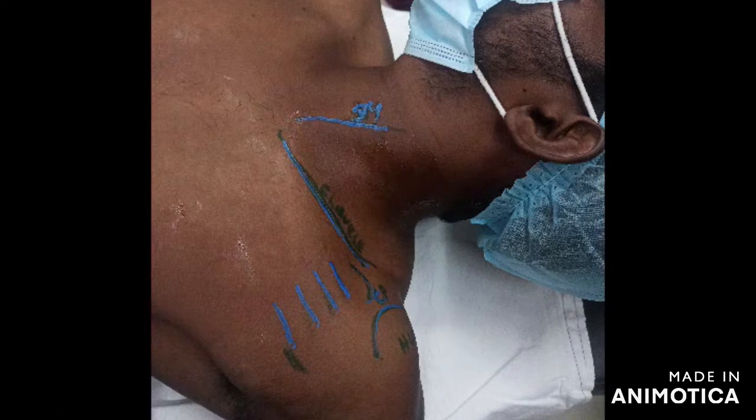To know the median infraclavicular fossa anatomy, we need to know four contiguous positions. First, the linear high-frequency probe needs to be put in a transverse oblique direction. The first level is the level of the clavicle, next is the level of the subclavius muscle, and next is the level of the cephalic vein.